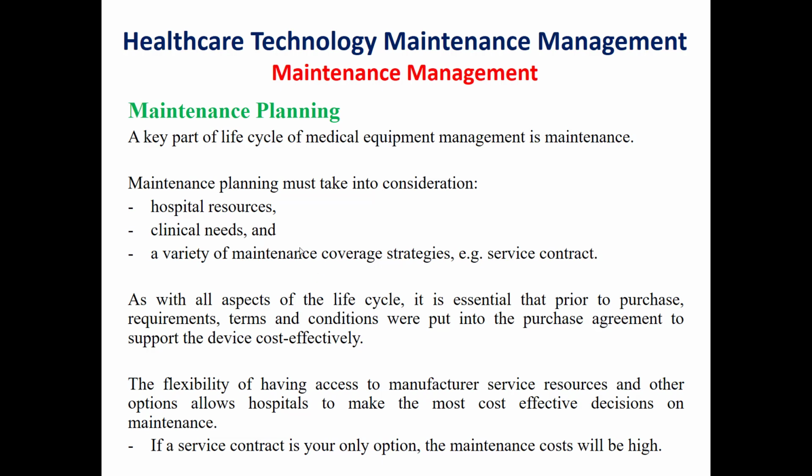An important point in the maintenance planning is that it's essential prior to purchase that the required terms and conditions should be included in the purchase agreement to support the device cost effectively. Thus, the cost of the spare parts, the cost for the maintenance labor hour, and other points should be considered during the signing of the purchase agreement.